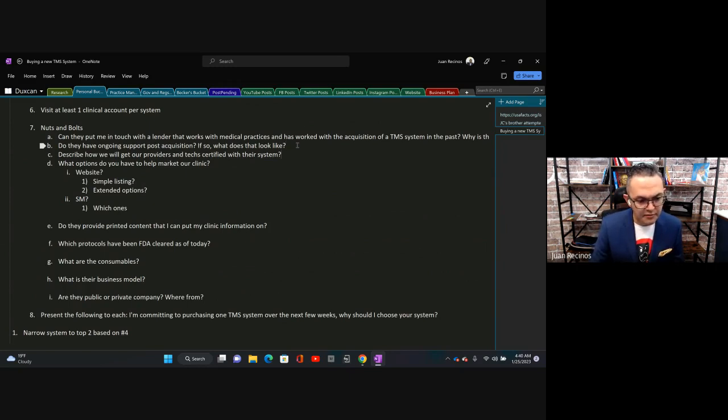Let's see, describe how we will get our providers and techs certified with your system. Specifically, do you have a workforce that's going to come to my site and train up one of my new providers that I need to get certified to become a TMS provider with that particular system? If I hire 5 more providers over the next year, will you be able to come in and train my providers up so that as an operation, I have more flexibility on who can do the mapping and all the other things that go into TMS?